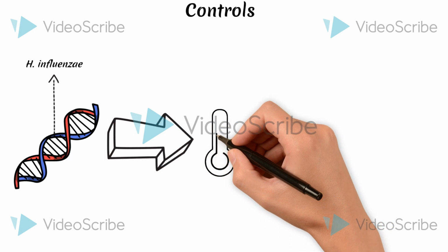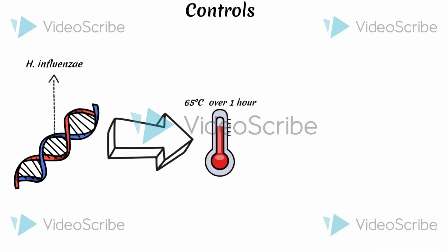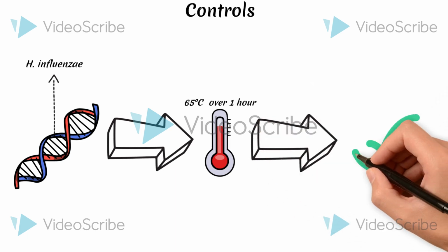Then, to assure these results, the mixtures have to be tested with LFB. The results obtained here can confirm that the primers were suitable for only Haemophilus influenzae detection with the LAMP-LFB assay.